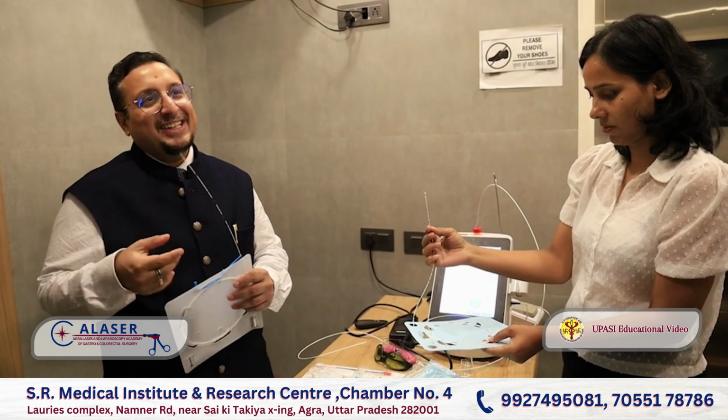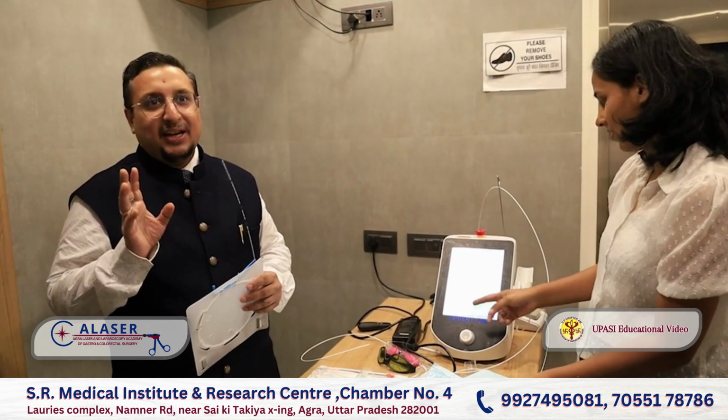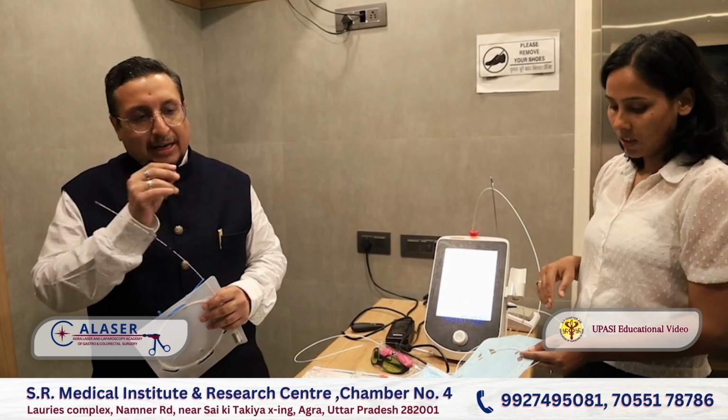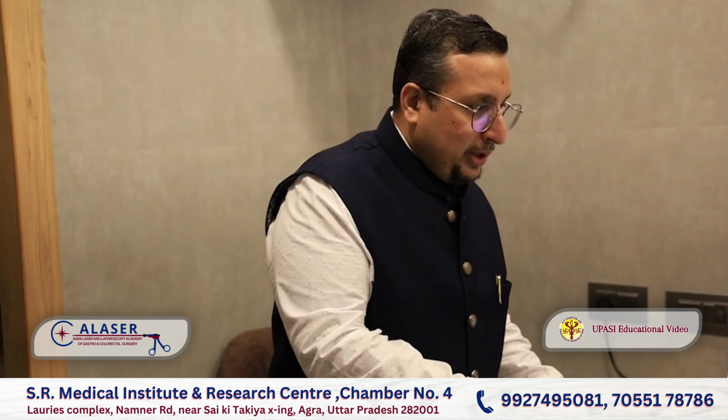इसको हम काट नहीं सकते. So इसकी लाइफ बहुत कम है. ठीक है, तो हमें खर्चा करना पड़ेगा, right? क्यों? क्योंकि this cannot be cut. Reusable है, but इसकी intensity goes down by down. Ideally they say 5 to 10 cases. We can use it in many more cases, but the intensity goes down. We cannot cut this fiber. And in bare fiber, the beauty is that you cut and use. You can use it multiple number of times. This is your radial fiber, conical fiber.